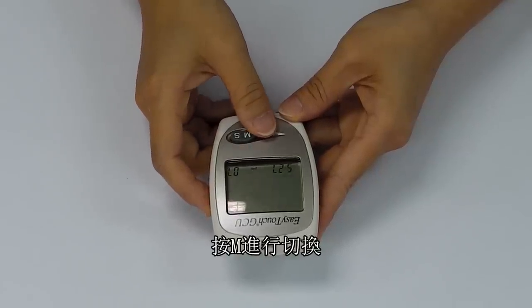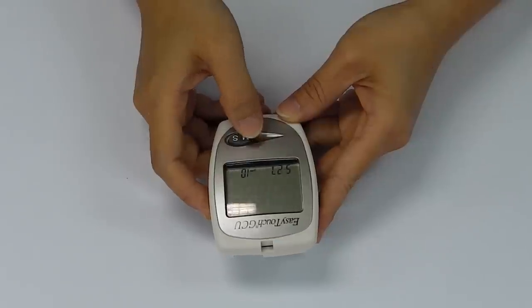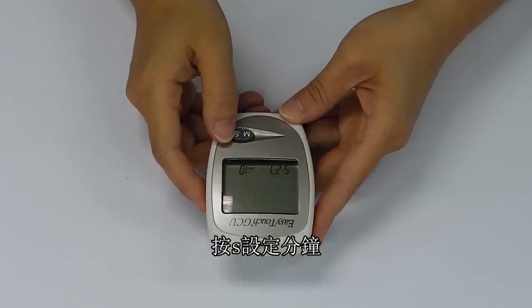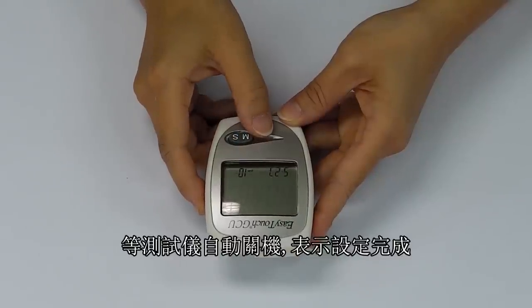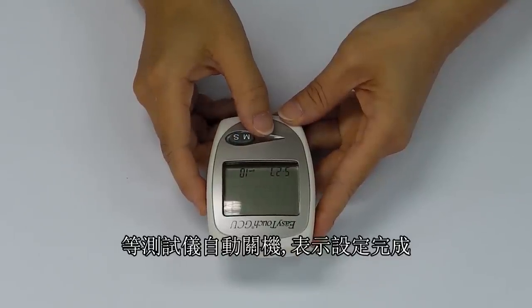Press M to shift to the minute. Press S to set the minute. Wait for the meter to turn off. The date is now set and your meter is ready for use.